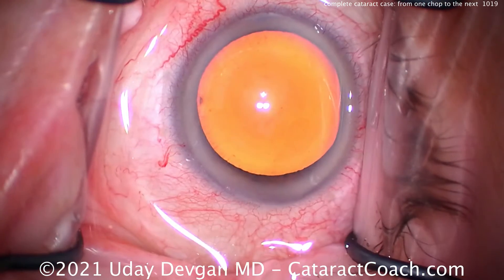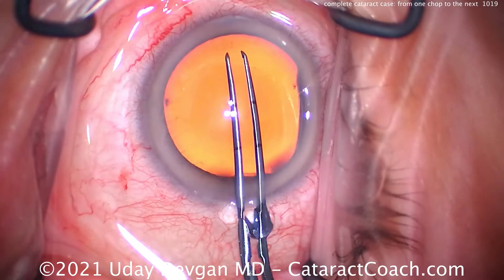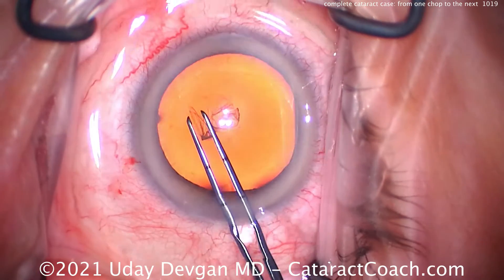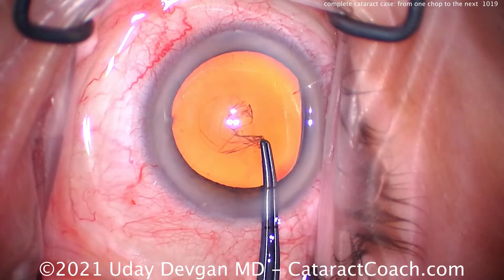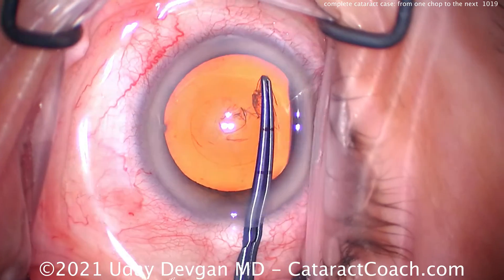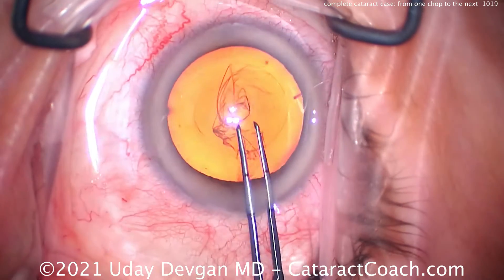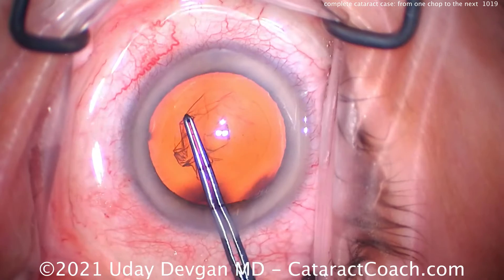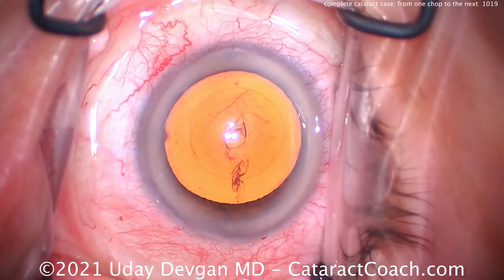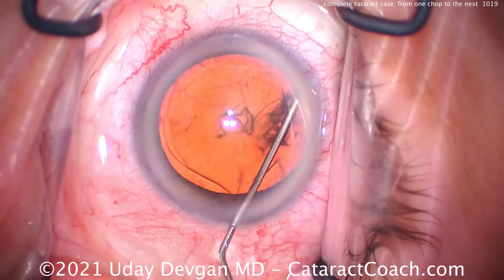Five millimeter capsulorhexis. We're going to show you the chop technique here. One mistake I see people making who are learning chop is they get the one chop and try to propagate it, it doesn't quite propagate, they try again, then they rotate and spend a lot of time preparing for the next chop. Whereas you want to actually move from one chop to the next chop to the next chop in succession. That efficiency is not about speed, but about spending less time in the eye, causing less iatrogenic problems, being minimally invasive.